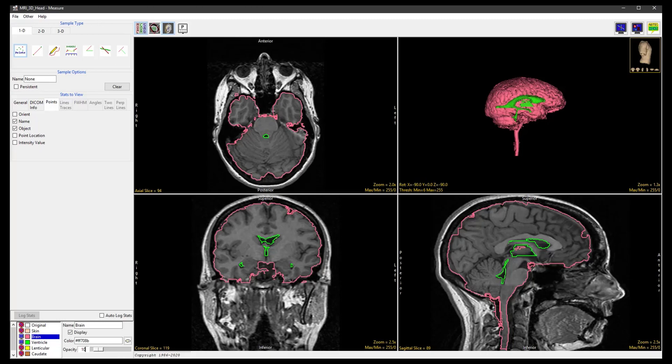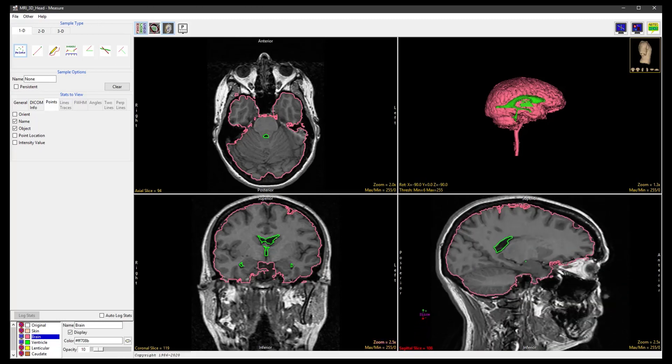Next, in the Sagittal Display panel, use the Slice tool to select a mid-sagittal slice.